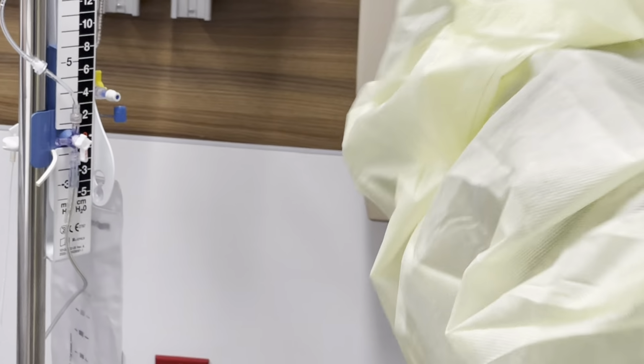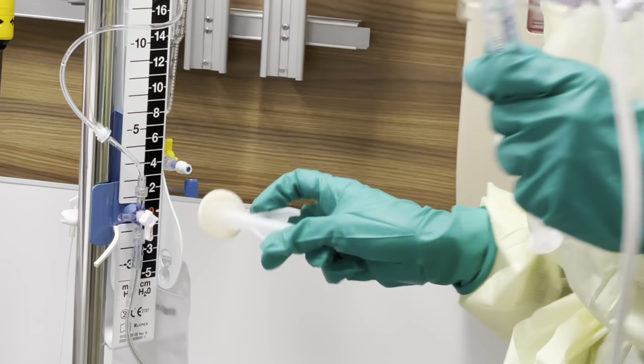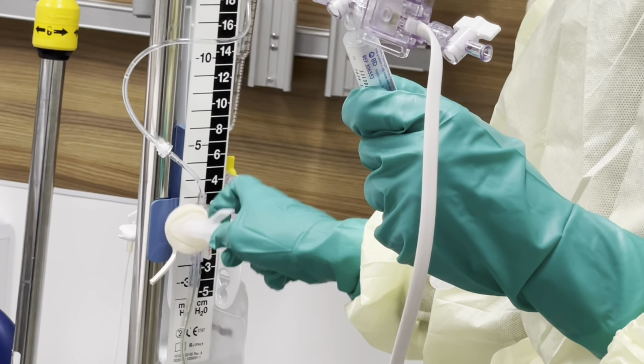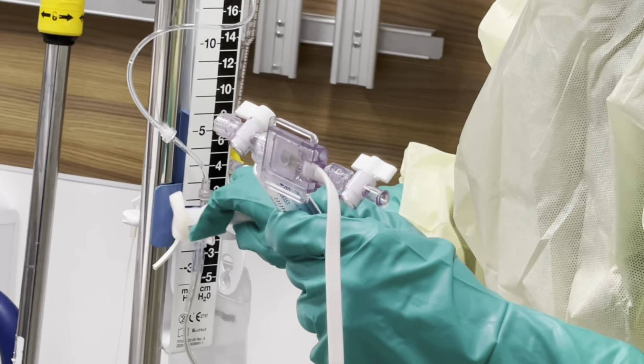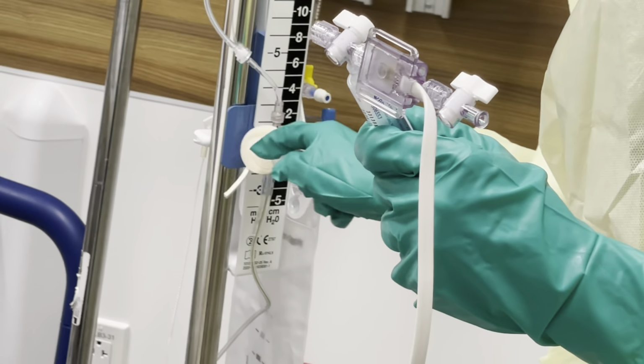We are once again gonna take a brand new clean, sterile CHG, and we're gonna scrub the insertion site here. Scrub this little hub over here, because now we're gonna add our transducer to it, and we wanna make sure that anything that's coming up over here is nice and clean, okay? We don't want any reason, again, that any bacteria is gonna get in there.